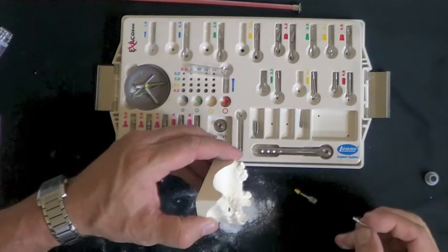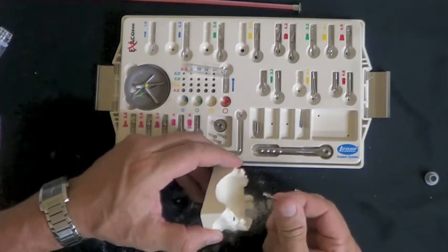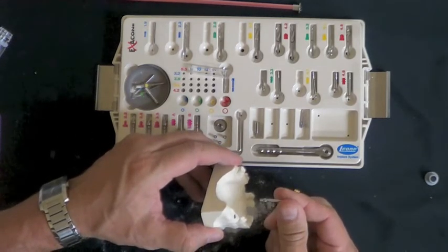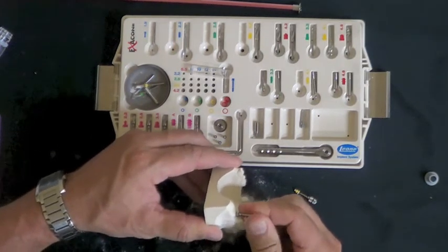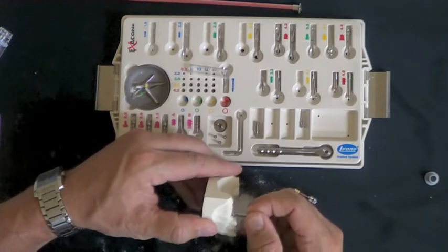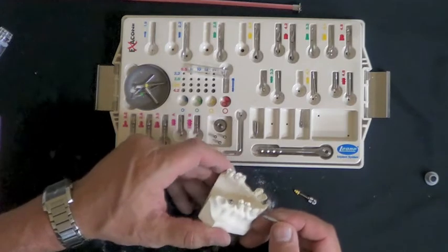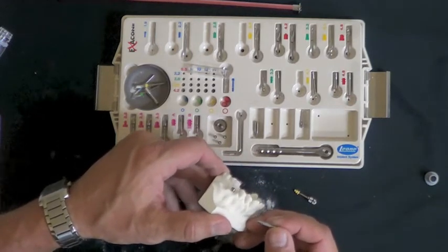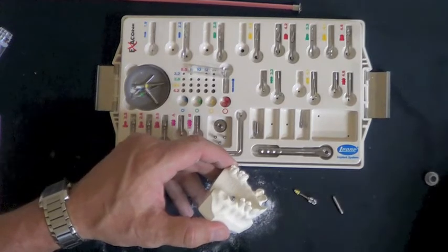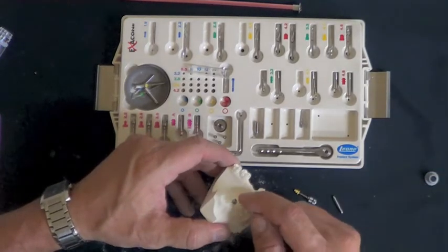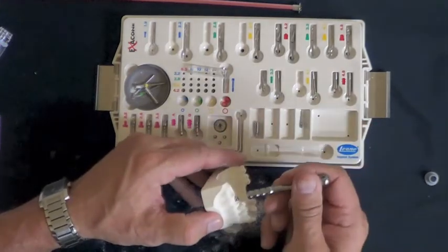At that point, if you want to place the healing cap, the healing cap comes packaged looking like this on a metal connector. Simply insert the healing cap into the implant until it seats and then rotate the connector off of the implant and then you'll have your healing cap in position. This can be tapped into place with a mallet or an instrument to assure that it's fully seated.